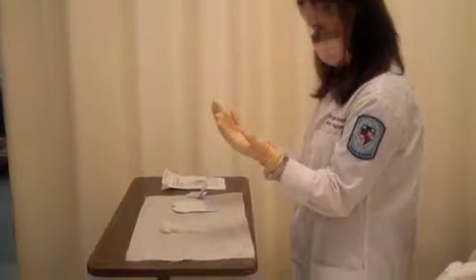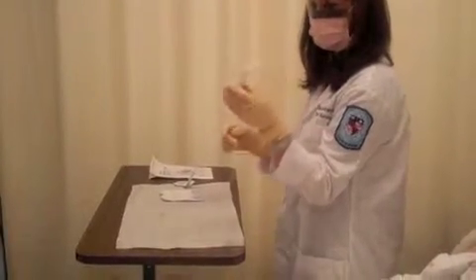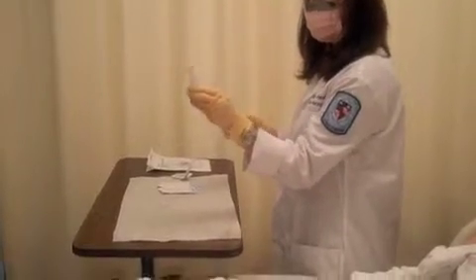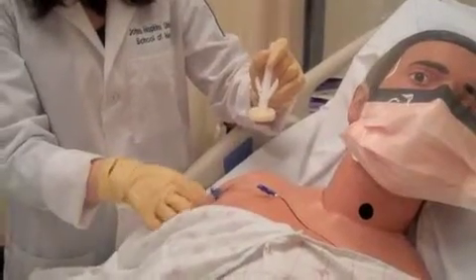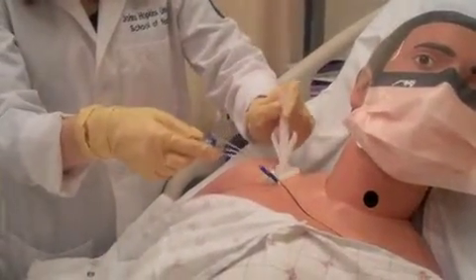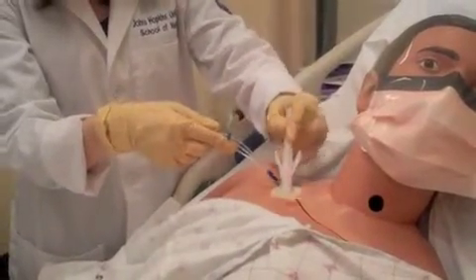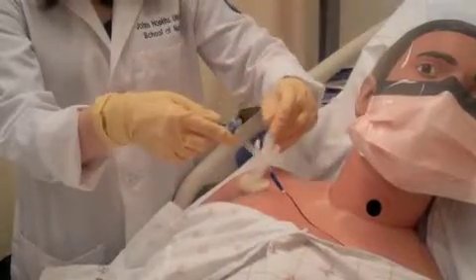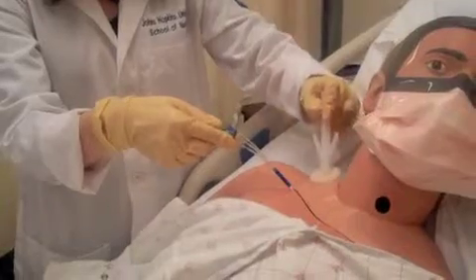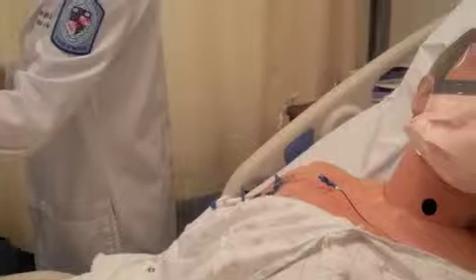Clean skin with the chlorhexidine swab. Begin directly at the insertion site and move swab in a circular fashion without retracing the area already done. Use friction when cleaning the area. You will now have one unsterile hand. Then allow the chlorhexidine to dry for 1 to 2 minutes. Do not blow or fan the site.